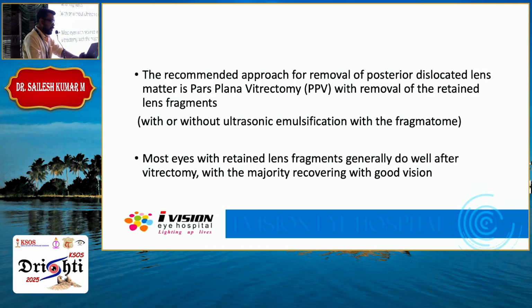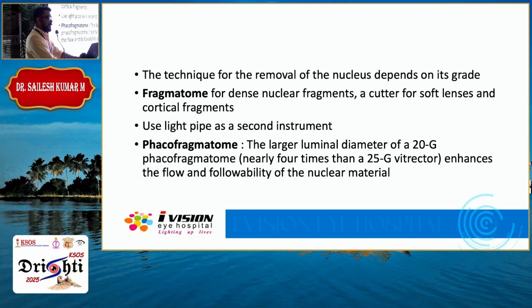So it's no more a dreaded complication if managed well and if communicated well with the patient. The technique for the removal of the nucleus depends on its grade. Soft lenses and cortical fragments may require a cutter only for removal. Dense nuclear fragments would require a fragmentome.